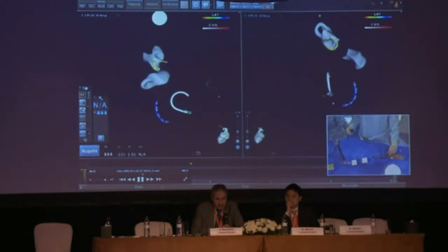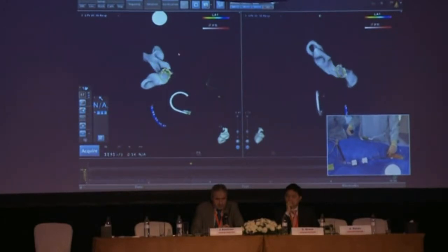It's quite a big left upper with quite a lot of branches, so we can see that as we begin to show a bit more geometry there. The left upper has clearly an upper and lower branch on it, and then we see the left lower that the PV catheter's in now. So I'm just filling in that geometry.